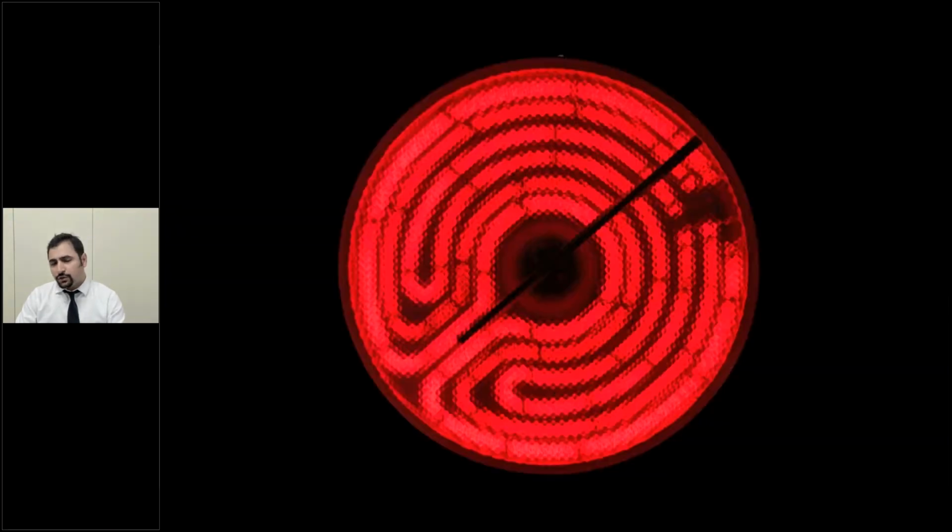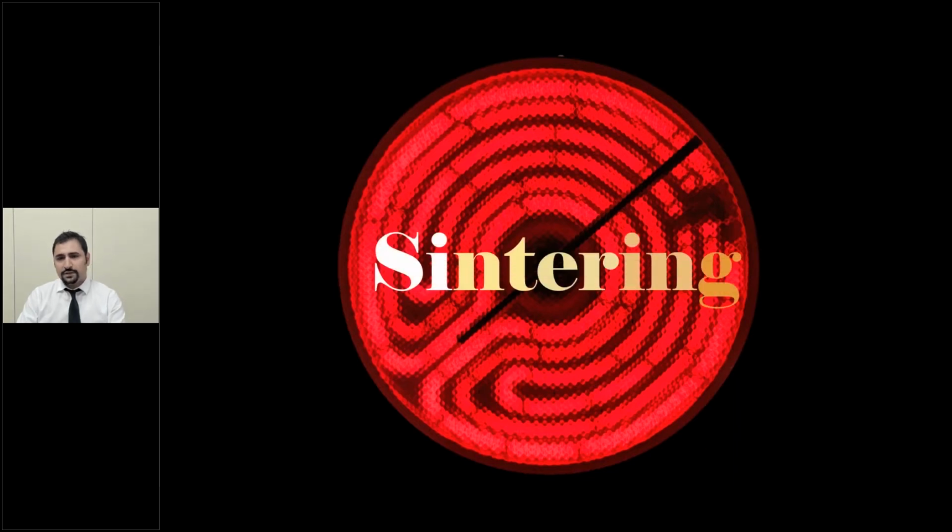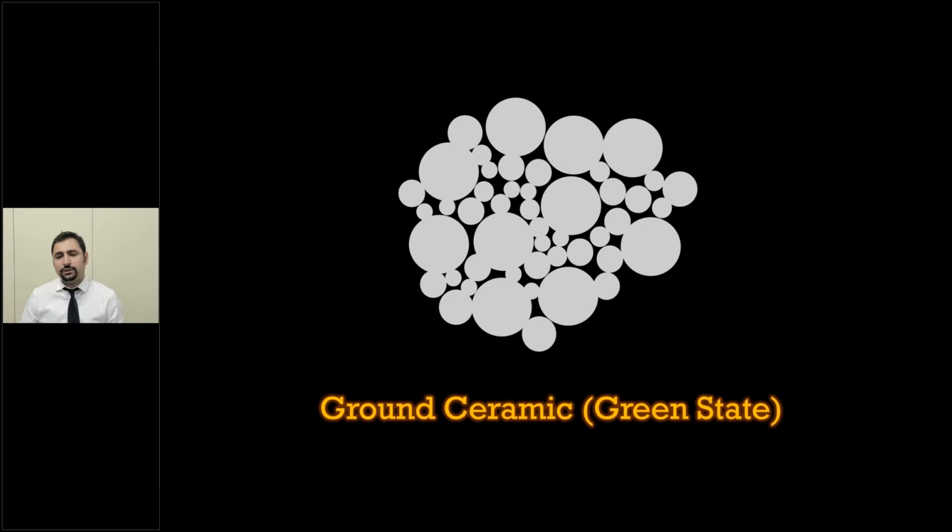Now, there's something very crucial when we talk about zirconia, and that's sintering. Sintering of zirconia is extremely crucial in terms of how it's going to affect the final product. Let's see how it does that. When we have a green state zirconia, there are particles. Remember that traditionally the powder was pressed together to form a disc. So in this pressed powder, there are spaces between the particles.